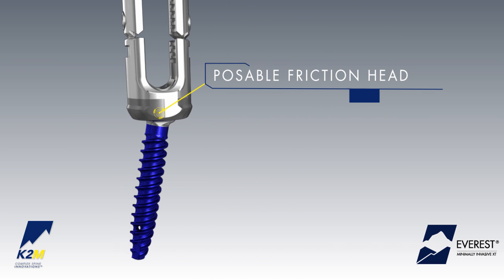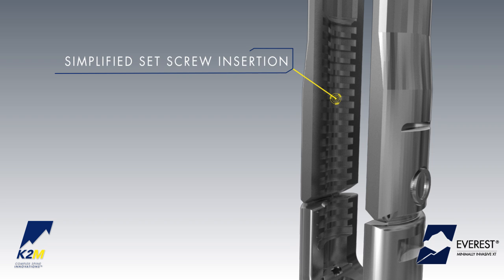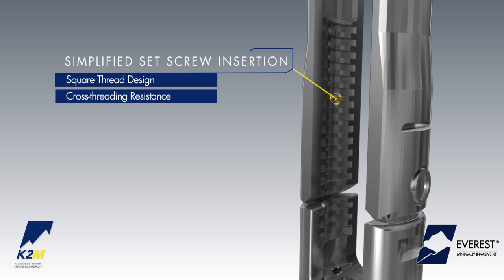A posable friction head assists with in-situ positioning of the screw, and a simplified approach to set screw insertion with a square thread design facilitates set screw introduction while reducing the potential for cross-threading.